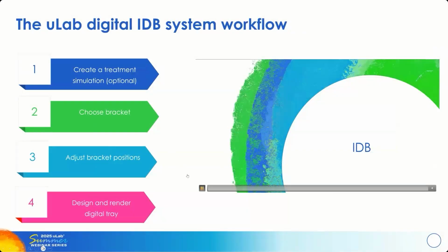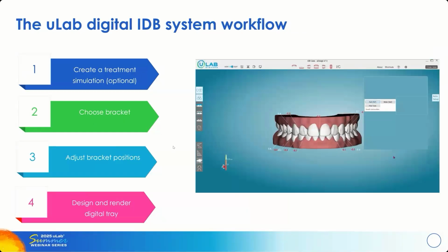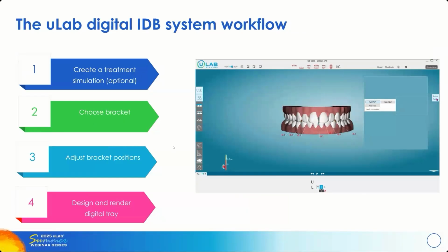So let's go through the process. It starts with, you can still to this day create a treatment plan. And we have a really automated system that can do it for you. But I want you to know that there are a lot of challenges with transferring that setup to the bracket, to the wires, and we're still working on this, right?